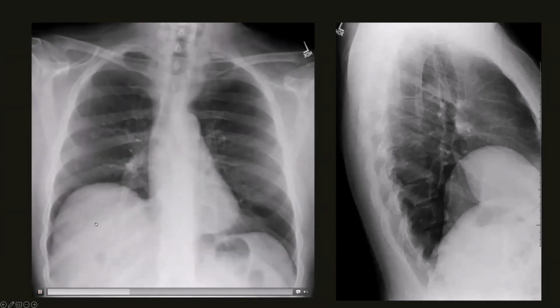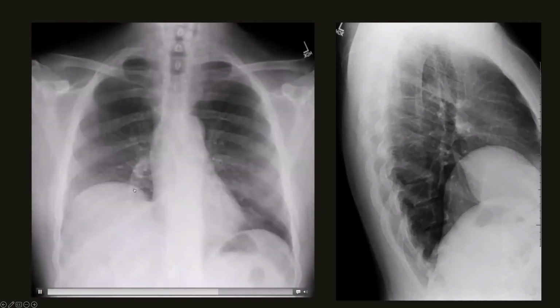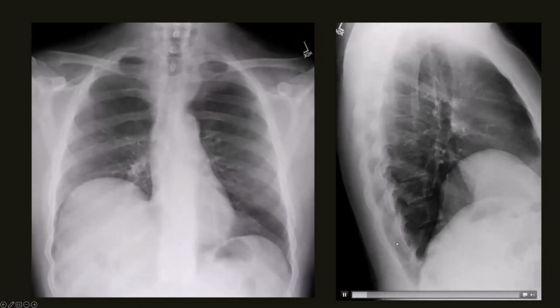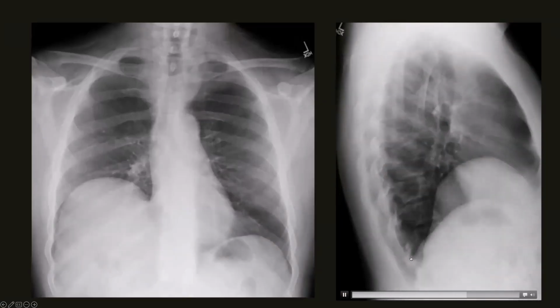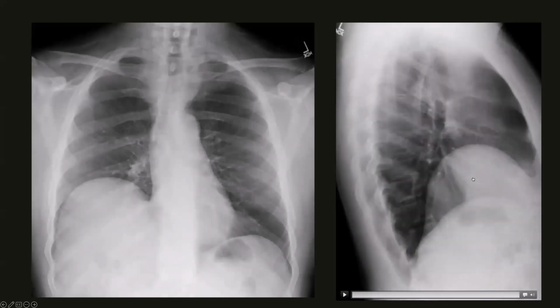And we have the frontal images here, where you can see this paradoxical motion of the eventrated portion of the right hemidiaphragm. You don't see that posterior shadow as well. But we also did lateral DDR on this patient. And what you can see here during the sniff portion of it, right here, is that the posterior aspect of the right hemidiaphragm is moving very rigorously, whereas the anterior portion of the right hemidiaphragm is showing that paradoxical motion. Again, this is an example of eventration.